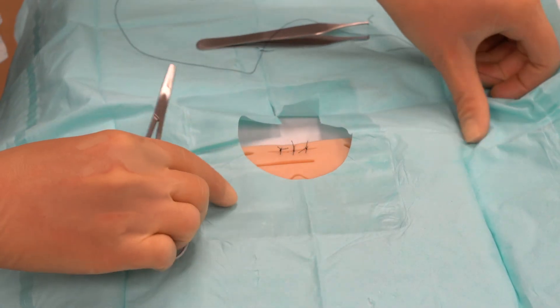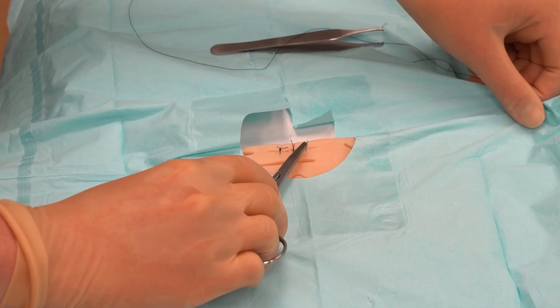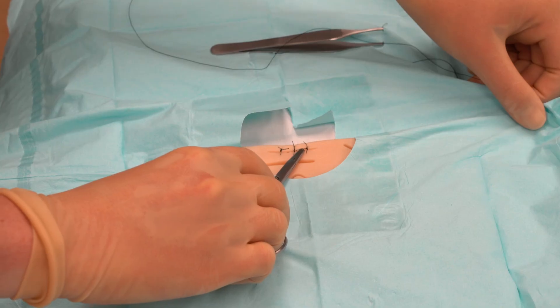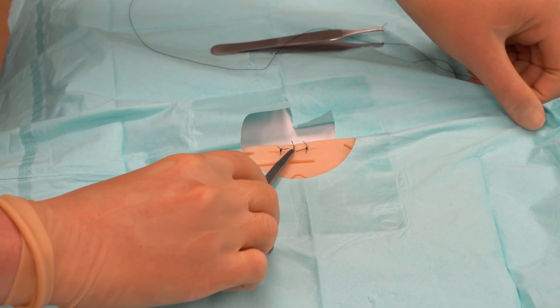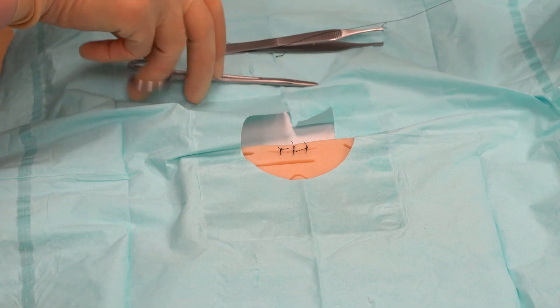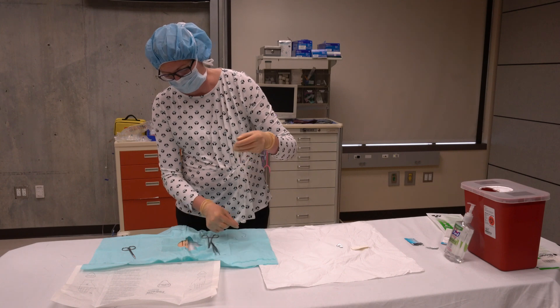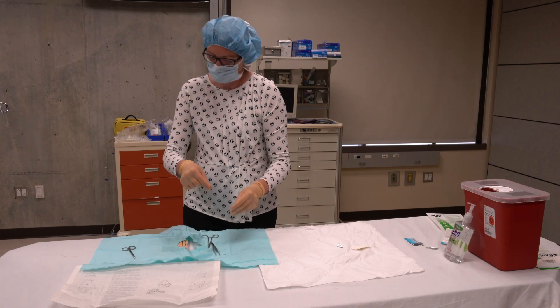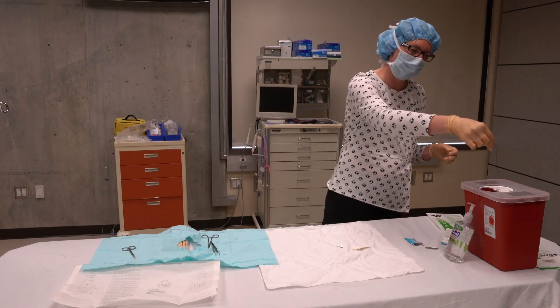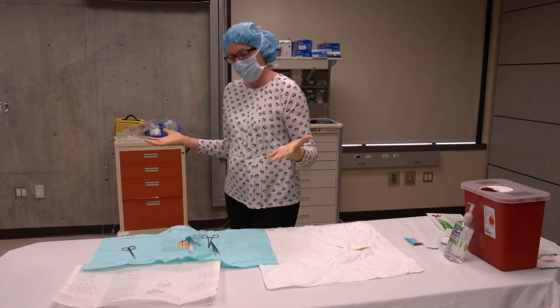Looking at the wound, the first suture is a little bit loose — the wound is not completely approximated, so in a real patient I would go back and place another suture next to it. But the second and third are nice, with the skin edges well approximated. After any procedure, safety of yourself and staff is important: take your needle to a red sharps container and dispose of it safely. And that concludes the procedure.